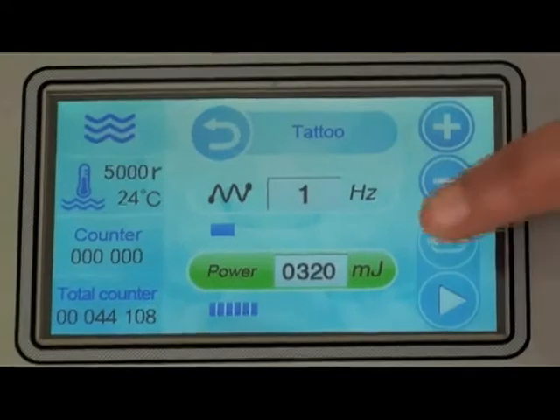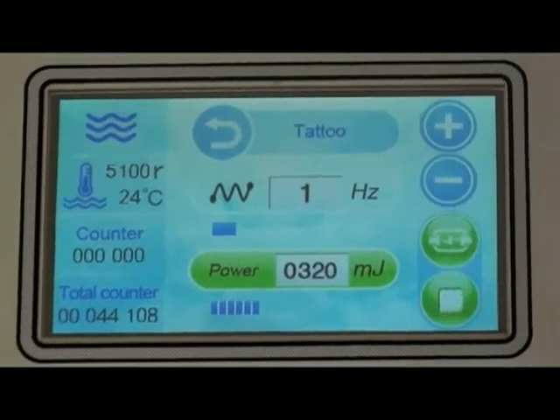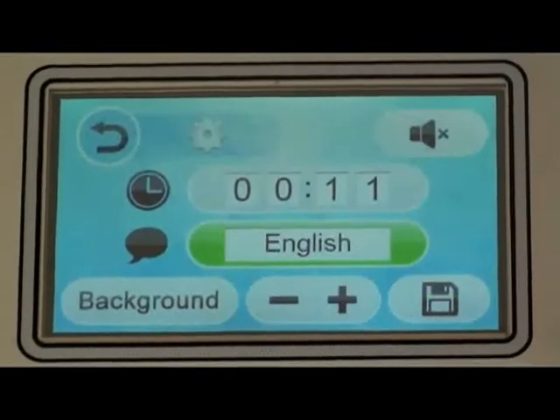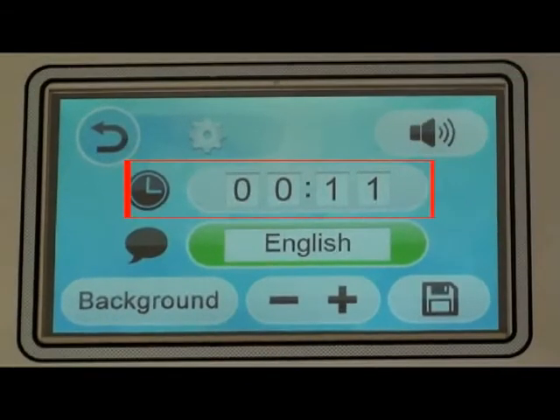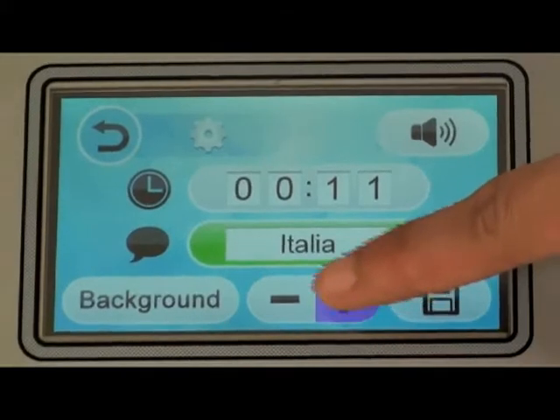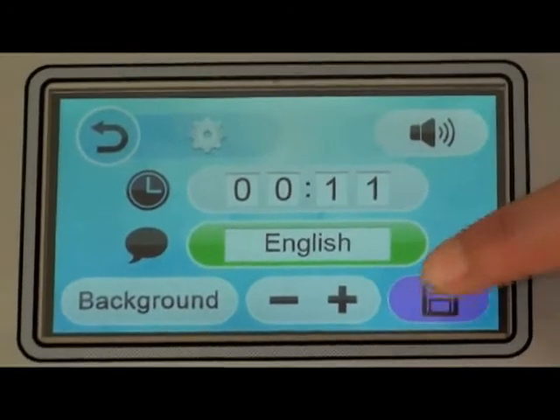Press the simmer button — hearing a crisp sound means the machine enters preparation/working state. Press work and the machine goes into working state. Press back to return to the main screen. Press settings for the background interface: press sound to select voice or muted, set local time with plus or minus, select local language, then press save to save your choices.